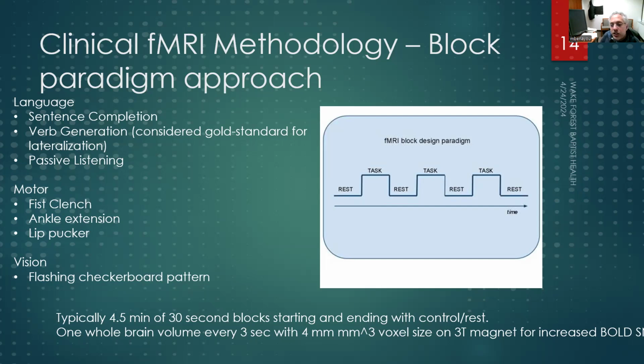And then for temporal resolution on fMRI, we actually acquire a complete brain volume every 2 to 3 seconds. So our sampling frequency is about every 2 to 3 seconds. So we're not sub-second resolution. And so there's a lot of opportunity if you're thinking about network spatiotemporal dynamics for things like EEG.